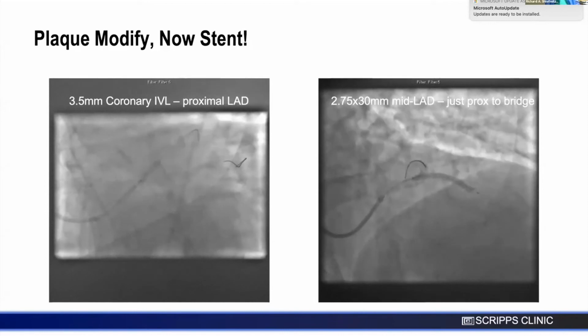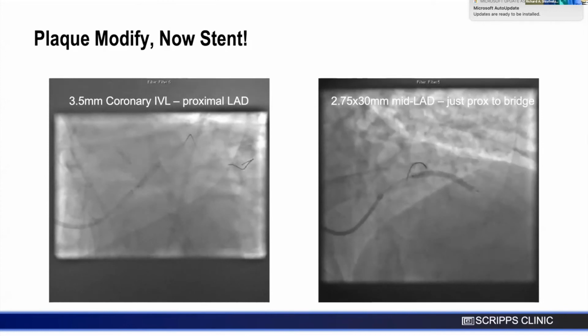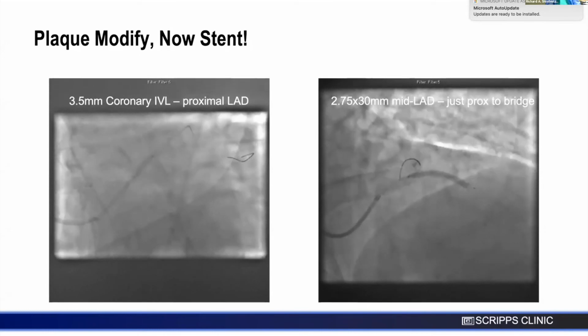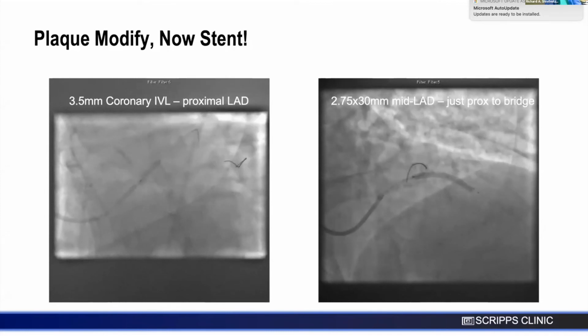So an important point, Matt, like on OCT, you see bridges a lot clearer. And the way you see a bridge on OCT is you see a perfect EEL with a 1.5 lumen, right? But the EEL is perfect. So negative remodeling. Right. So you're sure that there's a lesion there, but you see a perfect vessel without plaque. And as you well pointed out, very at the origin of it is where you always see a tight lesion.